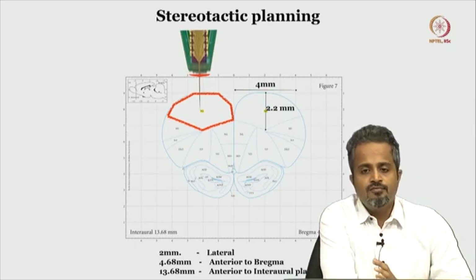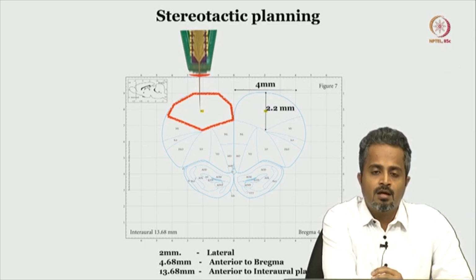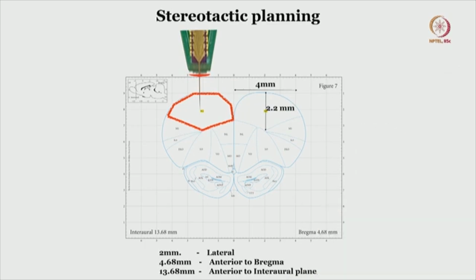The first and foremost is the stereotactic planning. When I say stereotactic planning, it is not the methodology aspect, as the entire methodology is different. When it comes to the planning, you need to figure out the entry point, where exactly you are going to make the burr hole. That is going to have a bigger bearing. Unless you plan your entire surgery, every single step has to be planned before you execute it, for a simple reason that it can't be undone. So better you have a mental picture of every single step that you are going to perform.